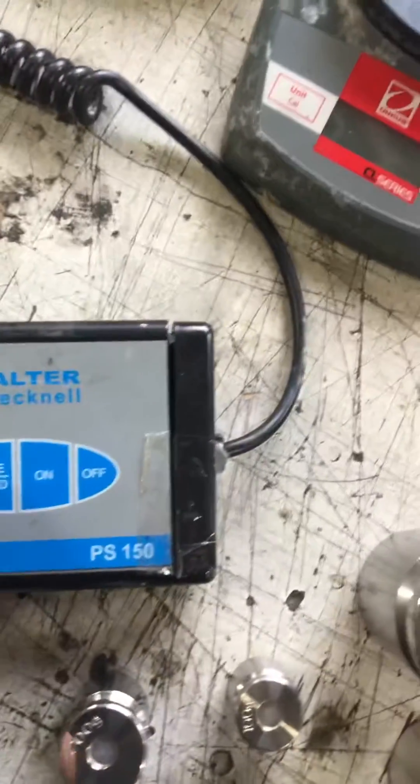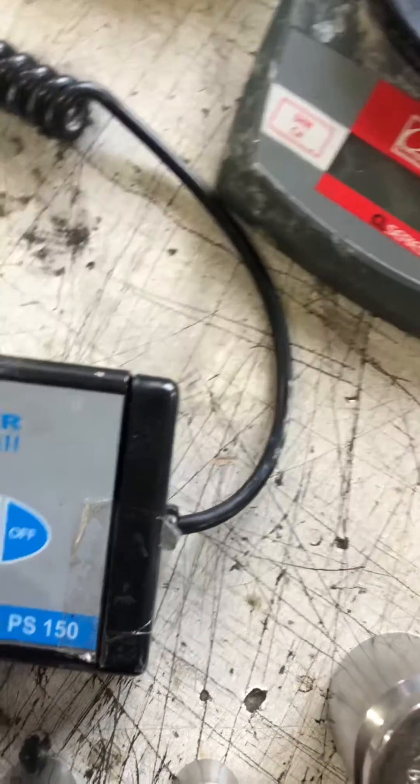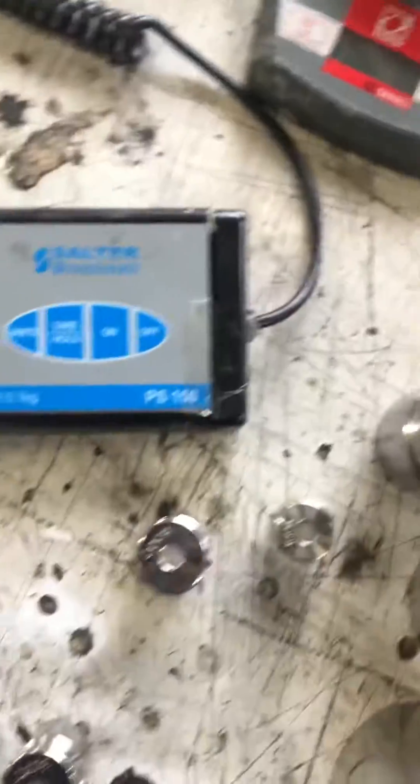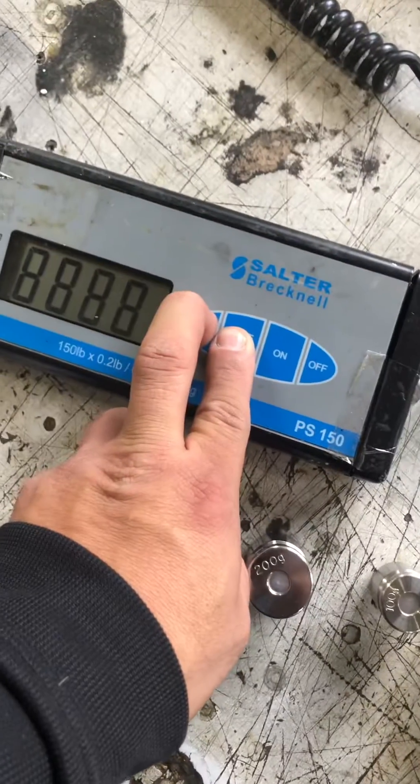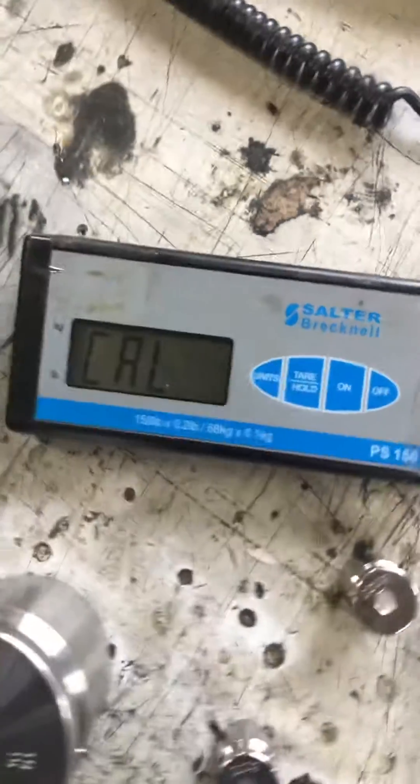You've got to hold these two keys while pressing the on key. Let's see if I can do this while holding the phone. Press on, hold the keys, and when you read 'Cal' on the display, you let it go.